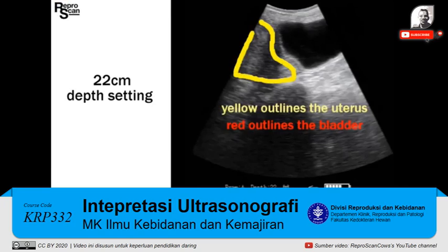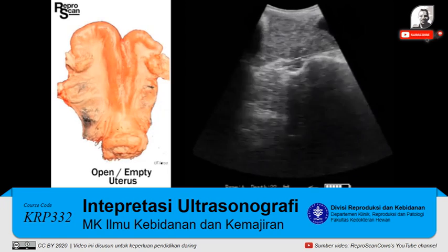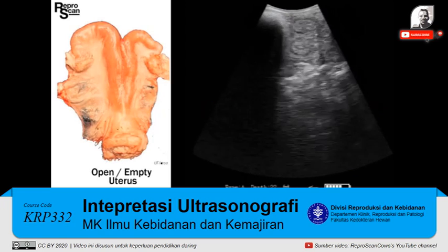Here we are outlining the uterus at 22 centimeter depth. There's the bladder. There's a cross-section — two cross-sections highlighted just above the pelvis.